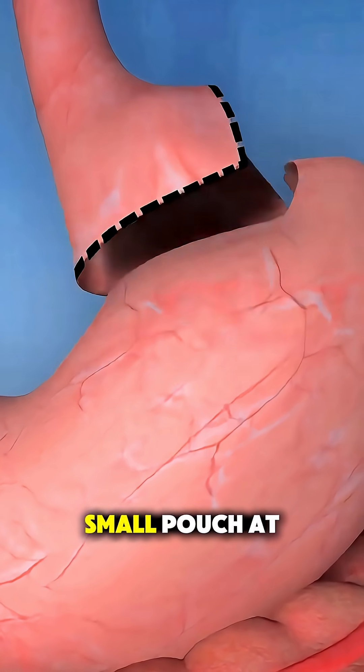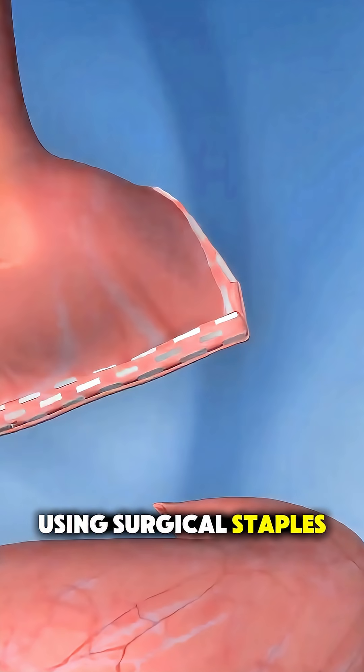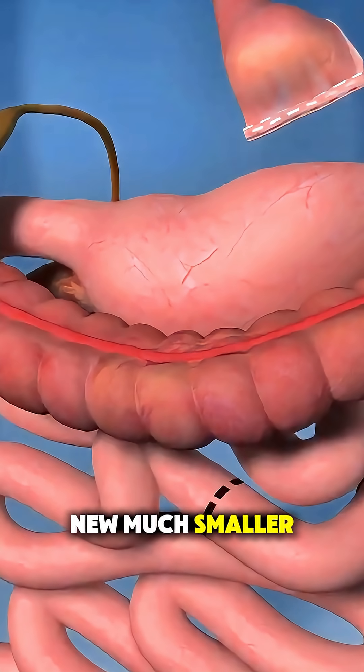First, they create a small pouch at the top of the stomach, about the size of an egg, using surgical staples. This becomes the new, much smaller stomach.